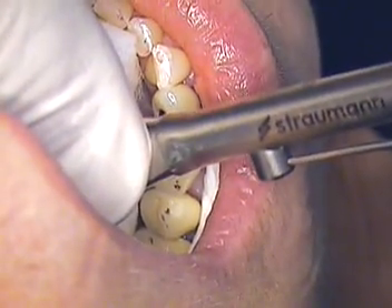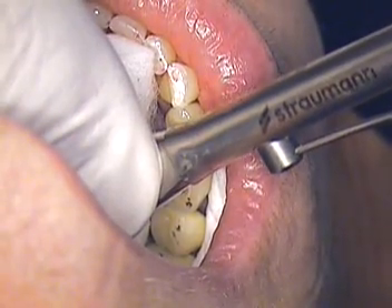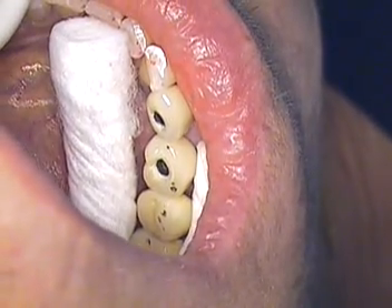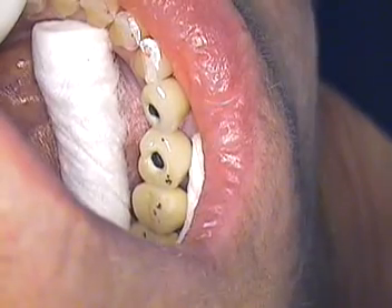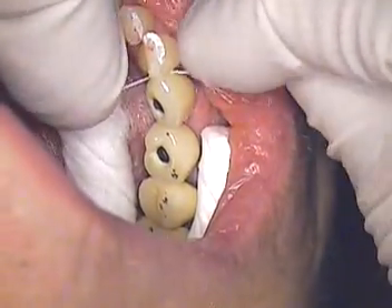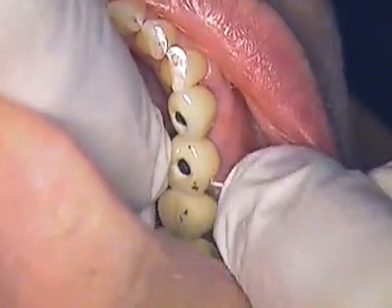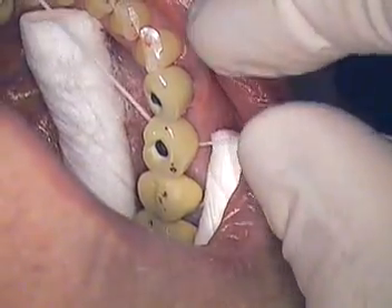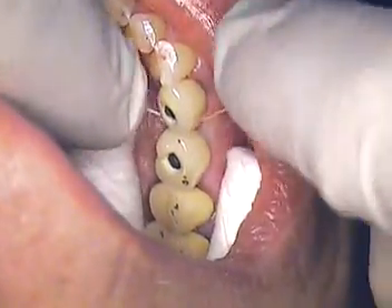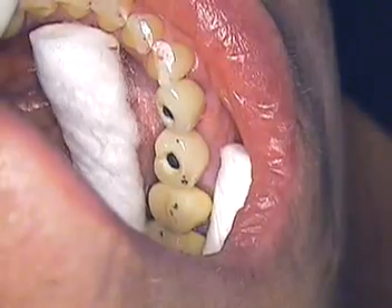None of this could be accomplished unless we had a passive fit. And we're right at 35 — perfect. Back in to check contacts. Perfect. We ask the patient if we can slide — and we make sure we slide that floss all the way up under the tissue. Perfect. Absolutely no obstruction whatsoever.